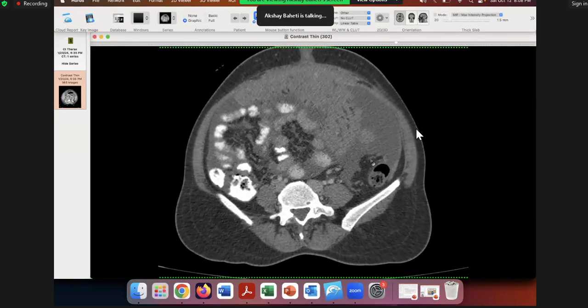And nodes, as I said, look carefully at all nodes when you look at ovarian cancer. Okay. Anything else in the Q&A? Let's see. Where is the Q&A? Yeah, here. Okay. Oh, that's a lot of questions.